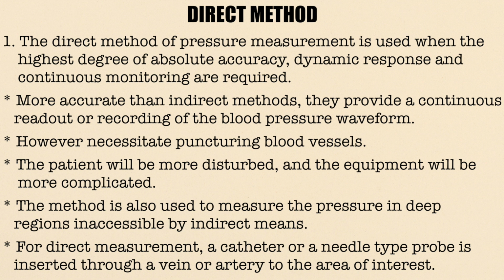They provide a continuous readout or recording of the blood pressure waveform. However, direct methods necessitate puncturing of blood vessels. The patient will be more disturbed and the equipment will be more complicated. The direct method is also used to measure the pressure in deep regions inaccessible by indirect means.